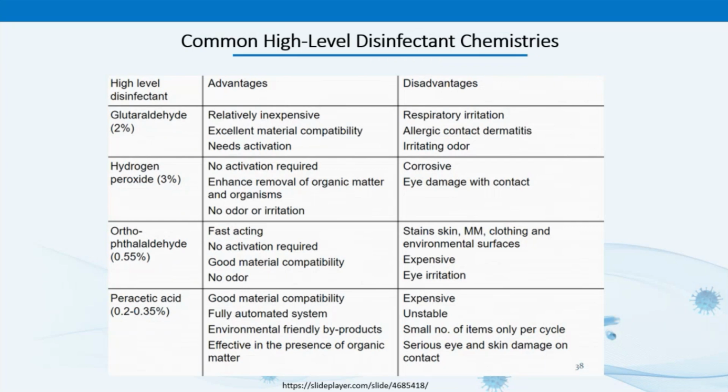Here's a list of some of the most common high-level disinfectant chemistries. They're cleared by the FDA as dependable high-level disinfectants as long as the correct parameters for time and temperature are met. Now, most have good material compatibility and are effective. However, they all tend to cause some sort of irritation.